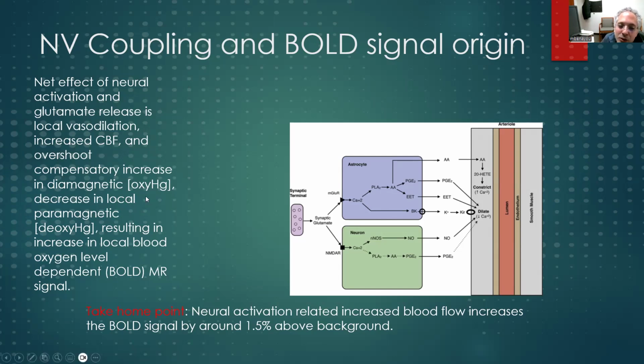And even if we don't know all the details of MRI and magnetic stuff, we do recognize that hemoglobin at its core is carrying oxygen with an iron atom. And pretty much all of us know that that's a pretty strong magnetic atom. So it may not surprise you to finally get to the bottom, which is that what we actually think fMRI BOLD signal is related to is the transition of oxyhemoglobin to deoxyhemoglobin, that you end up with an unchelated iron atom, which has a very strong magnetic field, and it can shield local protons pretty significantly, altering what they feel as a local magnetic field, ultimately changing their precession frequency in a way that's measurable.